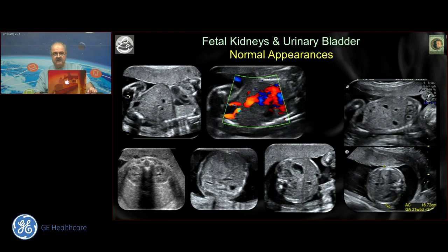Remember that when you look at the thorax and abdomen, you will always like to be sure that it shows a urinary bladder, and therefore you will watch the filling and the emptying of a urinary bladder. You will differentiate it from cystic spaces that you see around, including the stomach, the gallbladder, the portal sinus, and so on. And then go on to make sure that yes, indeed, the kidneys are kidneys.